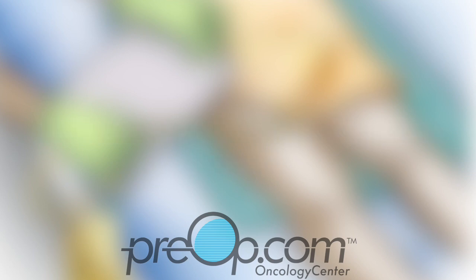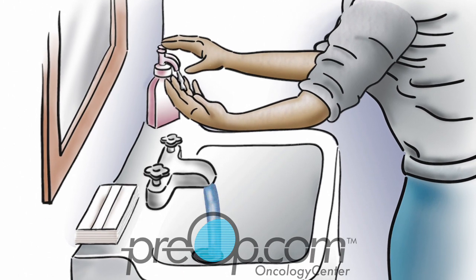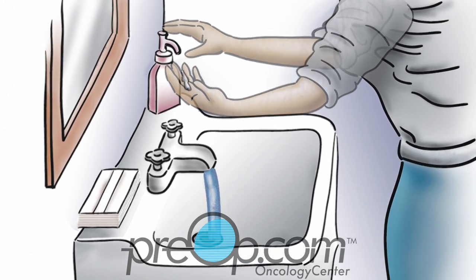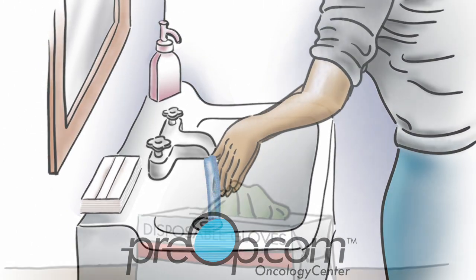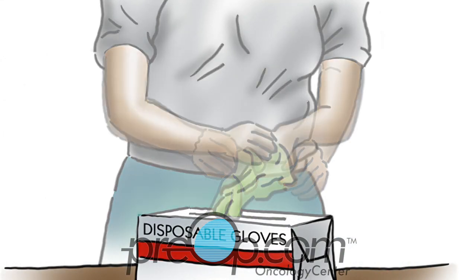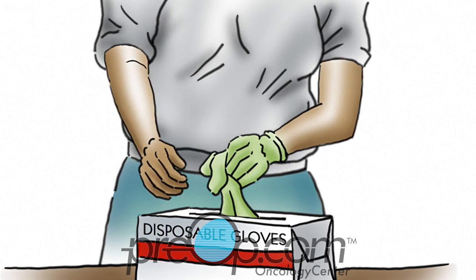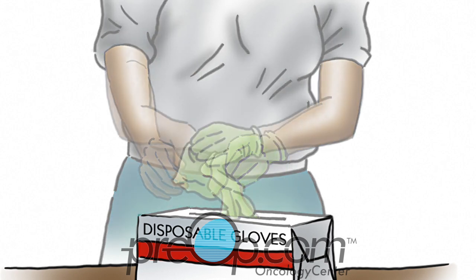Start all care by washing your hands with soap and water for 20 seconds and dry them. If you are doing the Foley care for another person, put on disposable gloves after hand washing. This is for your own protection, even if you are caring for a family member.